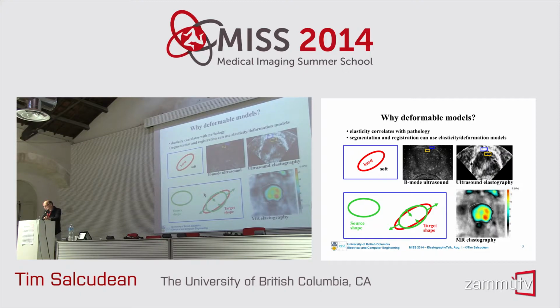Then it's also very useful for deformable registration. Everybody talks about deformable registration with an elastic potential, in which you have Lamé parameters, but you don't really know what they are. In many cases, though, you actually have those and can measure them. So why not measure them and use them so that you can deform a source shape into the target shape with the appropriate values of registration.